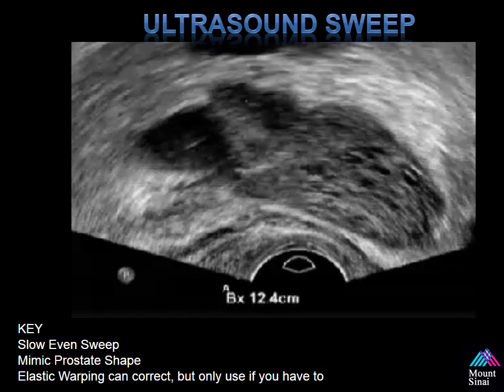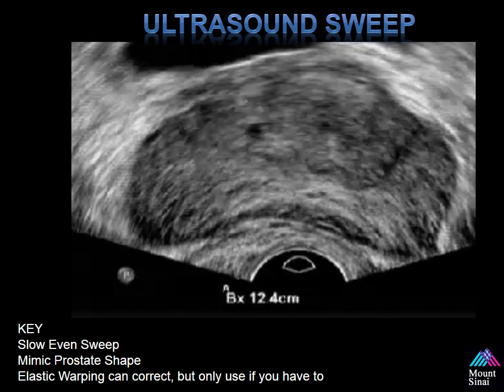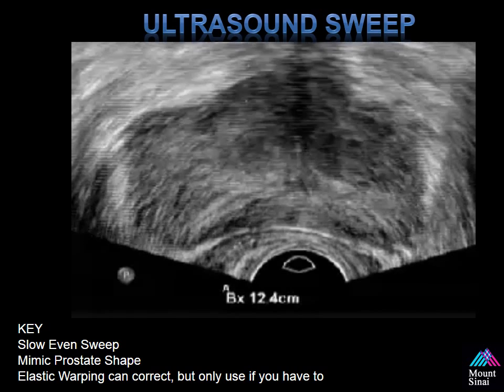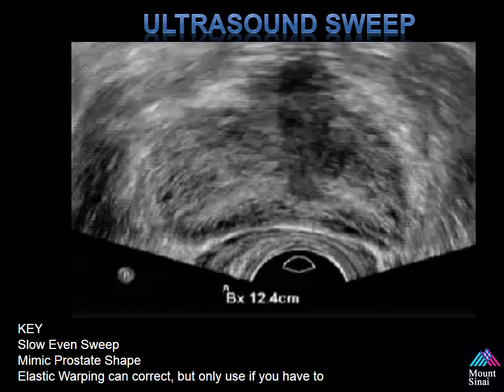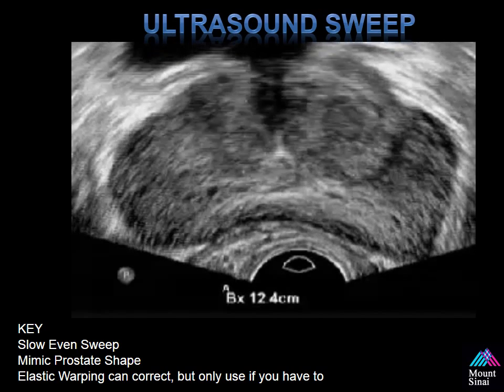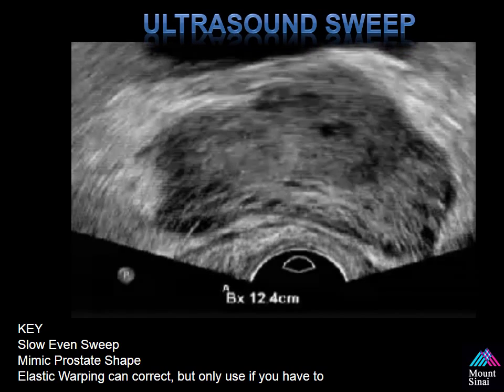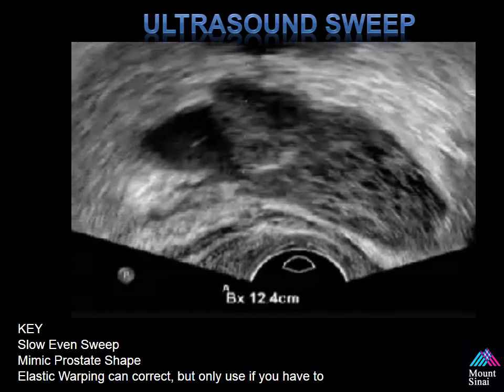This is an ultrasound sweep — you're taking a picture of the prostate. The sweep is important because this is how you obtain the ultrasound data set for surface rendering. Notice how in the lower corner frame, the edge of the prostate is always included within the entire picture. If you cut off a portion of the prostate during your sweep, the surface rendering will not work as well. There is some deformation of the prostate with your probe — you need to minimize this and optimize imaging at the same time. Elastic warping technology can correct this, though I typically don't use it because I like to see the raw images from both data sets and do any mental corrections myself.